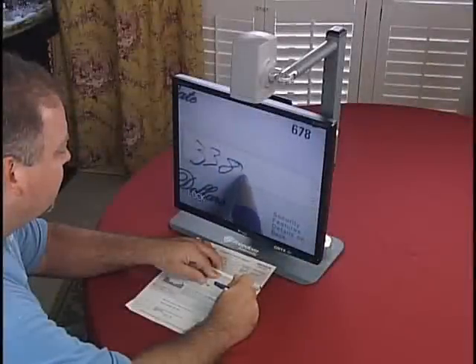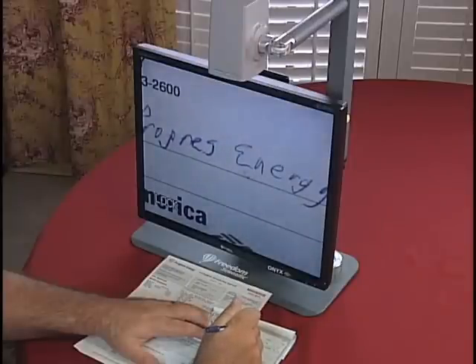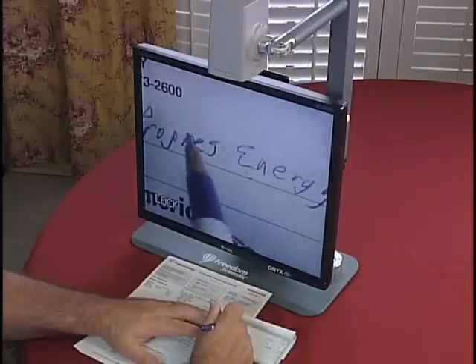By locking the focus on my check, I can clearly see that I'm writing the correct amount and making it out to the correct payee. I can even catch my own mistakes.